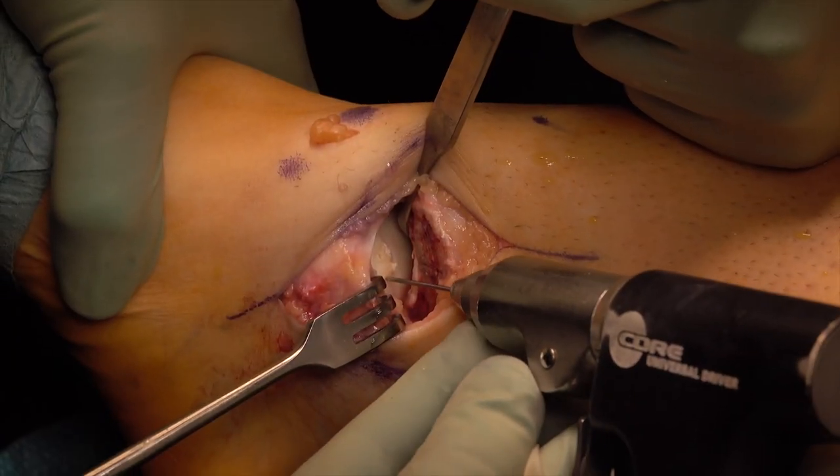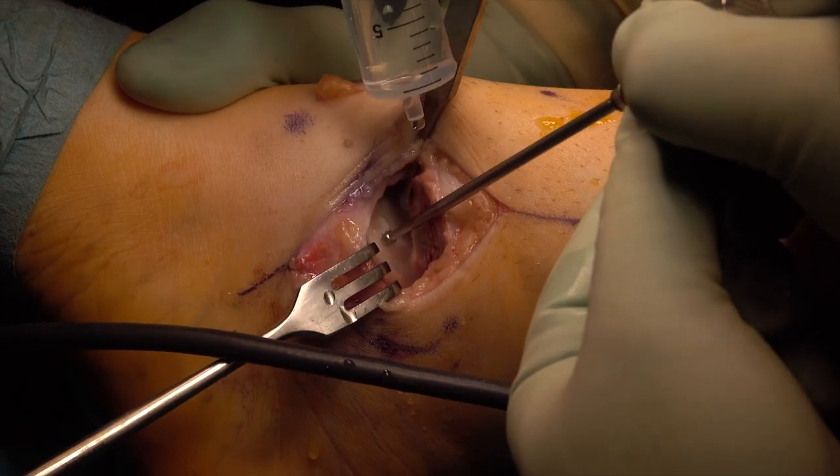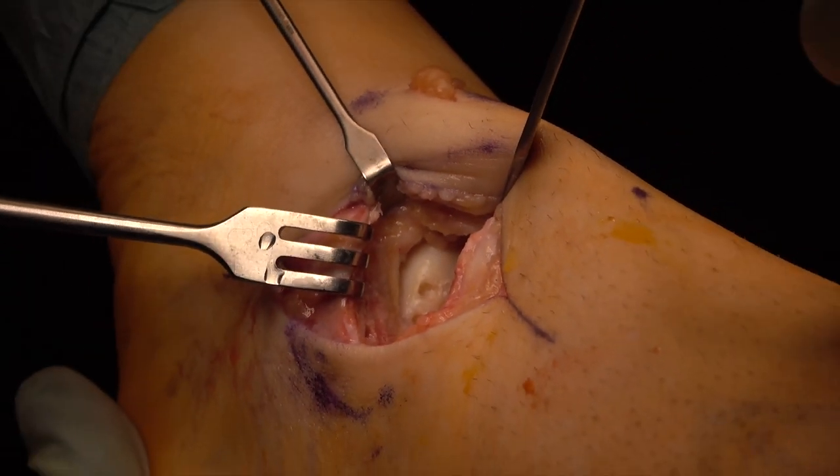Then a central hole is drilled into the top of the screw with a K-wire and deepened with a 3 mm ball drill to the bone-cartilage border. The area is then rinsed.